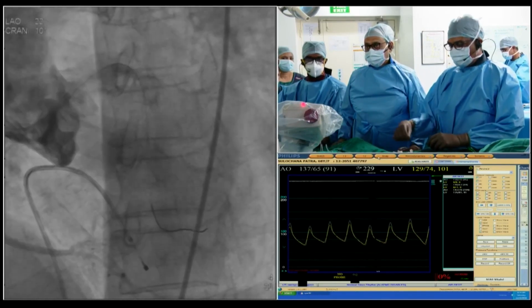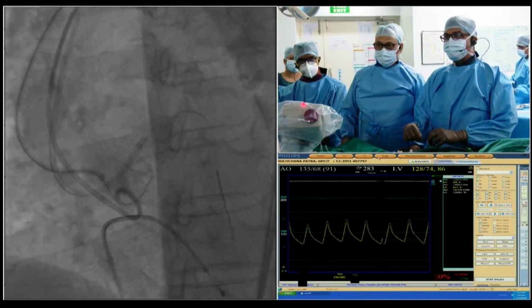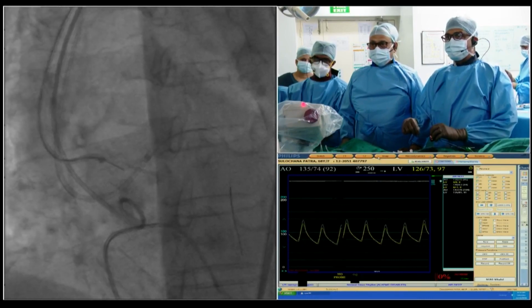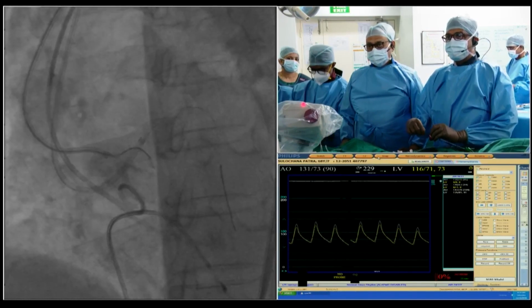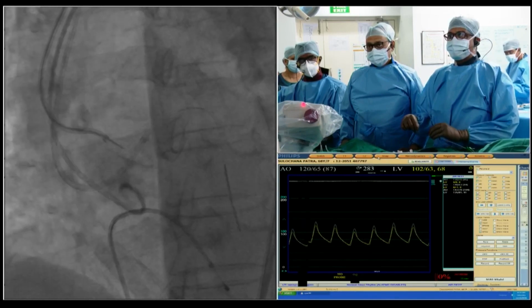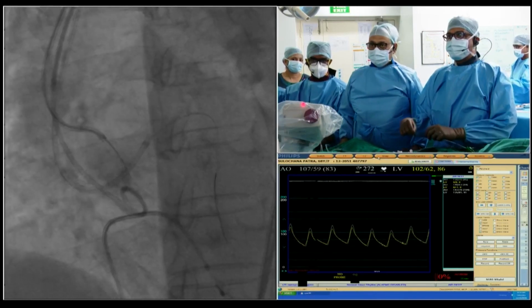So how many of you would just say, go ahead and protect the right coronary now, versus whether we should do balloon sizing? So that's the discussion. You can let us know what you feel. Although on the aortogram it looks like the right coronary height is also low, you have the CT which says it's a little more than 10. So both choices are okay, but certainly we would be much more confident if the right is also protected.